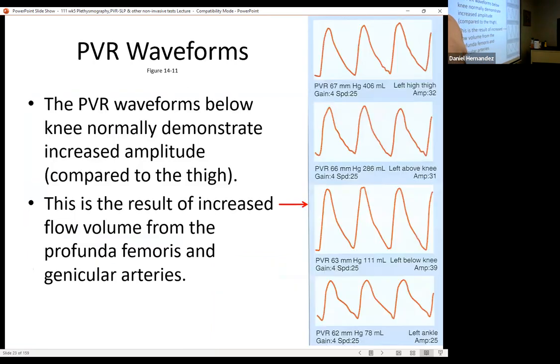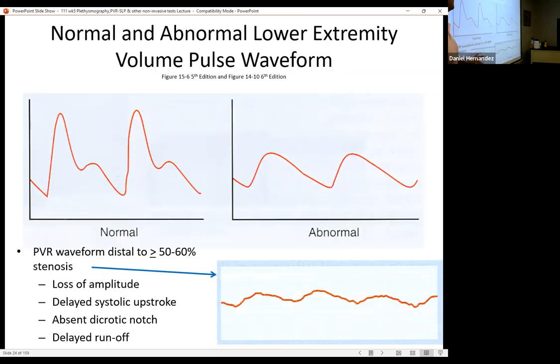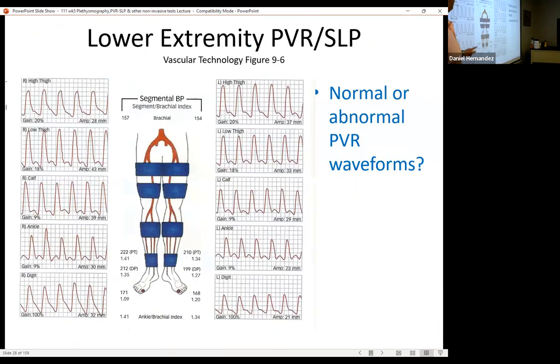But they are. And this is why I don't want to do vascular, because that's bullshit. When you were going through the real patient studies, none of them have it. Well, that one, I thought this is considered diastolic runoff. So really the only one that doesn't is the digits on the right. I feel like mine don't look like this. Not gonna lie, when I was doing it and you referred to the runoff and such.